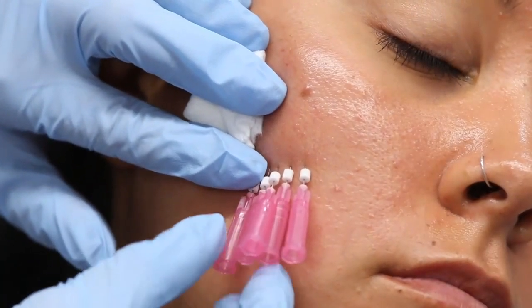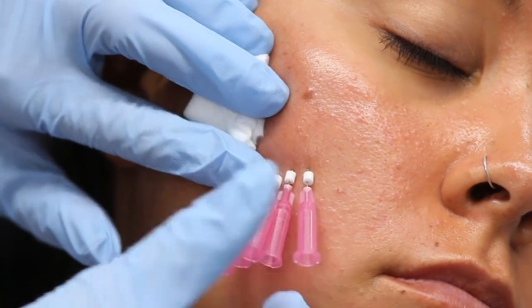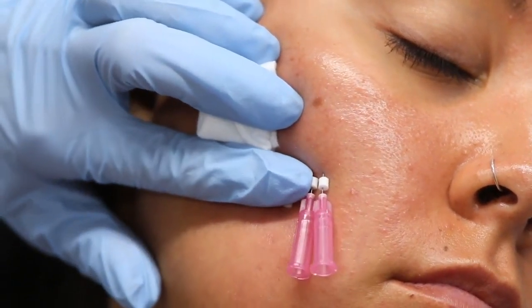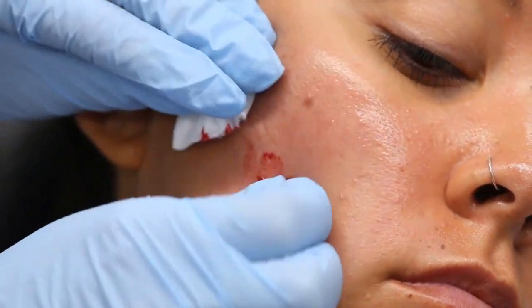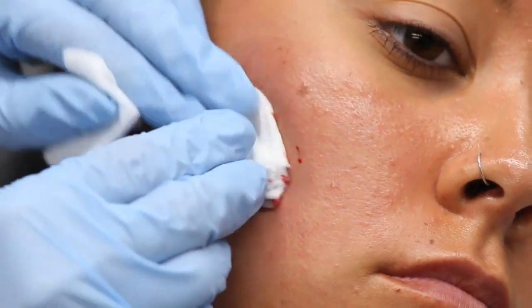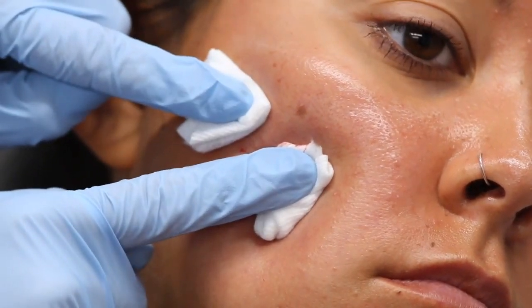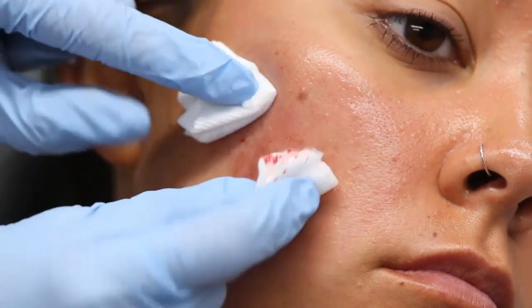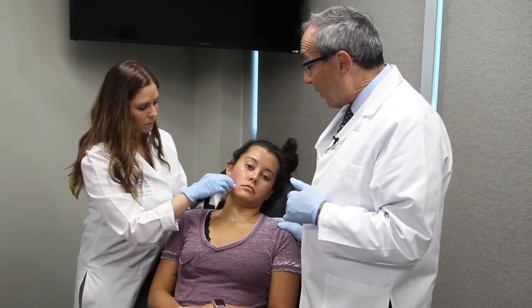She's had a cheek enhancement with solid filler PDO threads, these smooth threads. And we've seen it now over time. Patients are willing to wait for great skin and also a great cheek enhancement with just these solid filler threads. So at this point, it's just a matter of cleaning her up, and then she gets instructions. Since this is a fresh site, we don't want her to put on any old junky makeup that is bacteria infested or anything like that. Just keep it clean for the next few hours. She can put on very, very light makeup if she needs to.